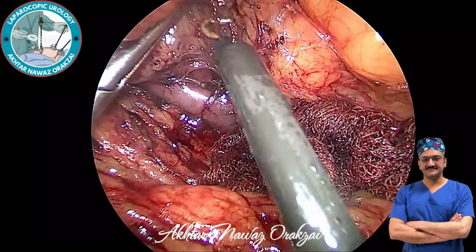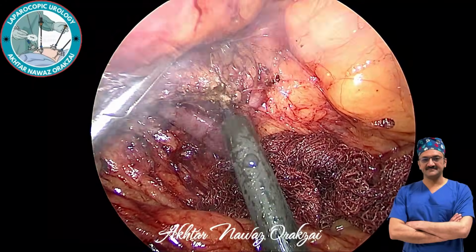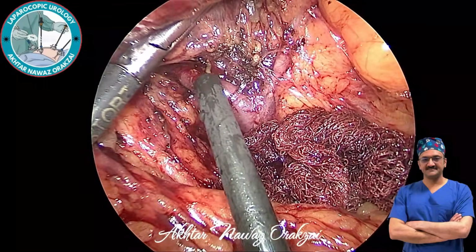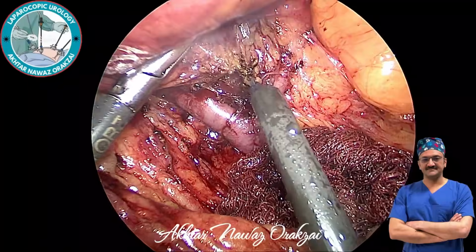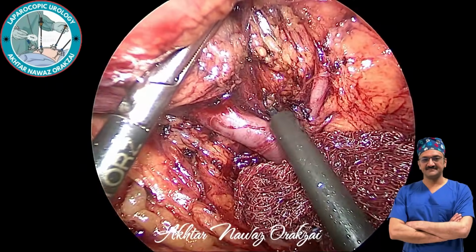So what I do is that here I use the monopolar hook, and care must be taken while using the monopolar hook here not to injure the artery to the superior pole.